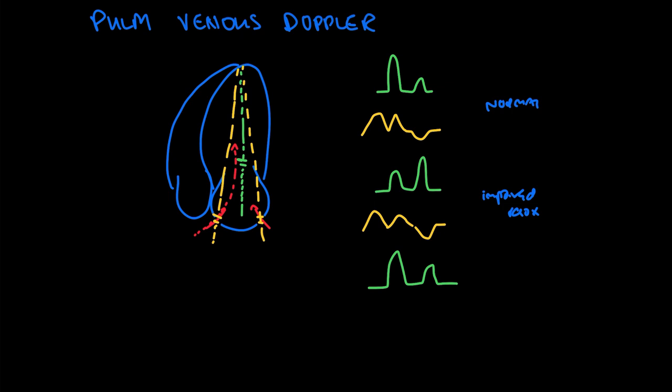So then what you'll see, and I realize I should have been labeling these, so let me label on top: this is the E wave, and the second wave is always going to be the A wave. For the pulmonic veins, we have the S wave that comes during systole, when we don't see any flow on the mitral. There's nothing that corresponds on the green. And then our D wave during diastole, the D and the E are during the same time, and then we'll call this our A reversal.